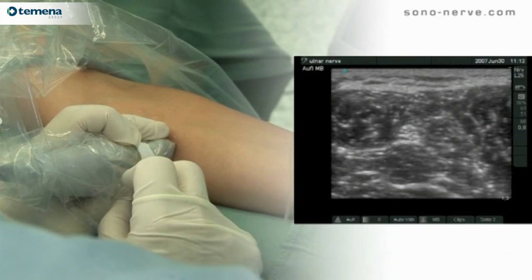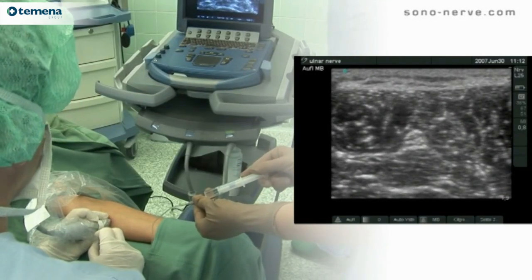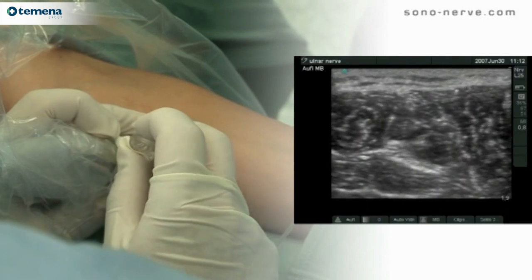Once the needle is in proximity to the nerve, local anesthetic is injected. The needle is then repositioned such that an injection is performed on both sides of the nerve so as to surround it with local anesthetic.